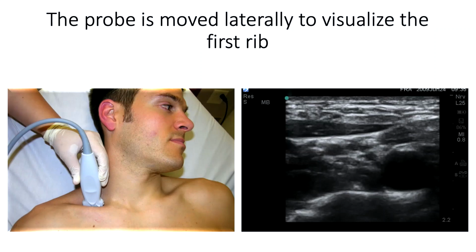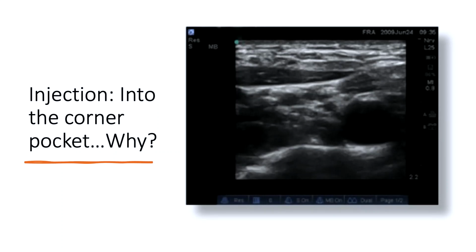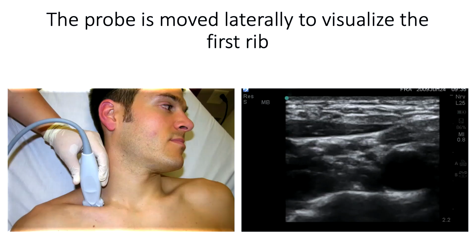But now, in between nerves, there is also connective tissue. So the same material that is part of the building block of a nerve occupies space between nerves, and that blurs the image. So now you know, or at least you should know now, that there are 7 nerves located there. You can't call them exactly one by one and say this is one, this is the other, but you can make a pretty much educated guess if it came to that.